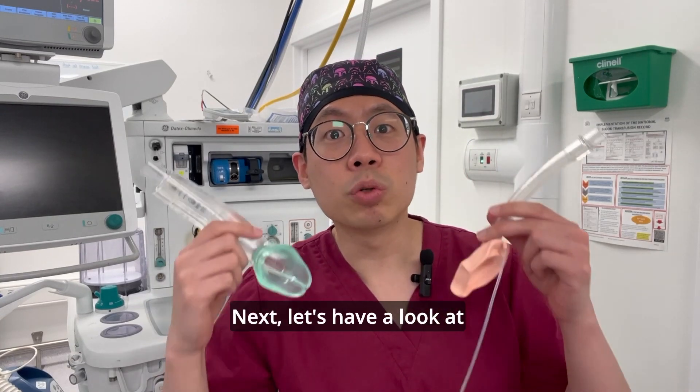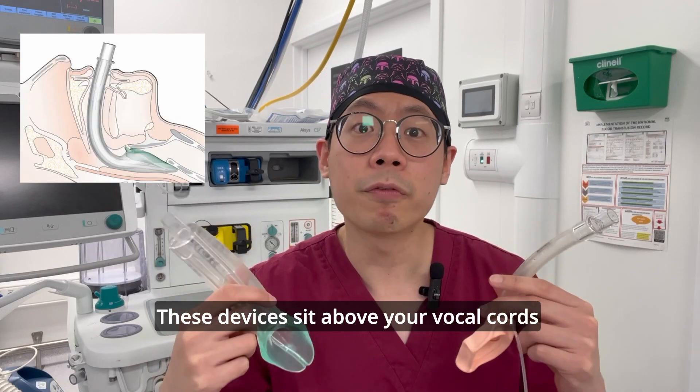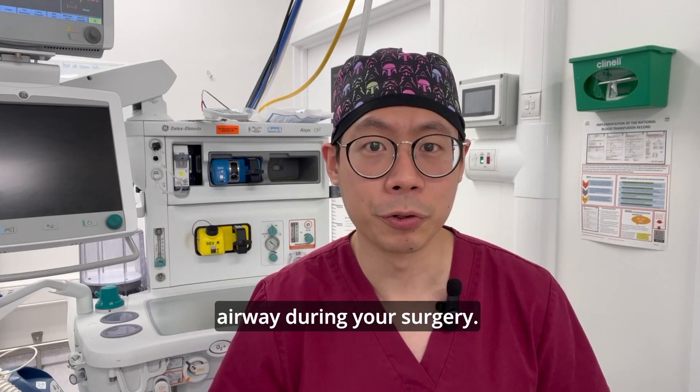Next, let's have a look at supraglottic airway devices. These devices sit above your vocal cords and allow us to improve oxygen delivery and also maintain a working airway during your surgery.